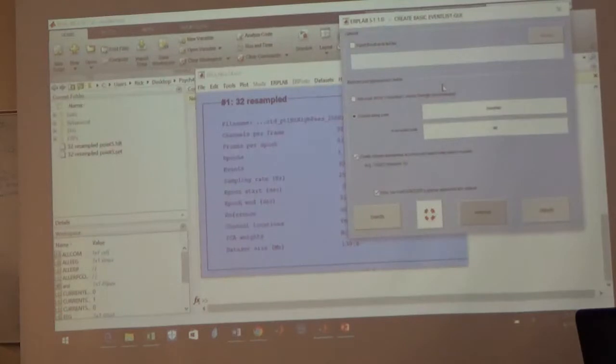Did anybody else get their message? Holy jeez. We all did. Goodness, okay. Well, we're gonna have to fix that up. What could have happened on that? You guys all have this version 5.1.1.0? Yeah. Okay. We'll sort this out.